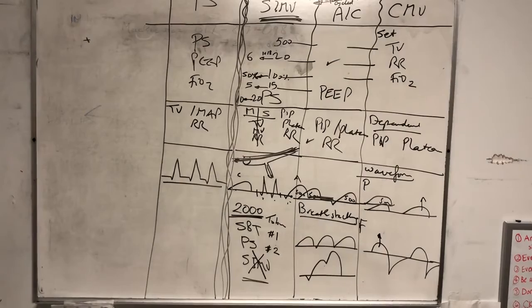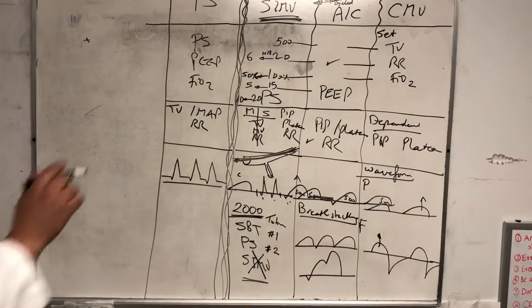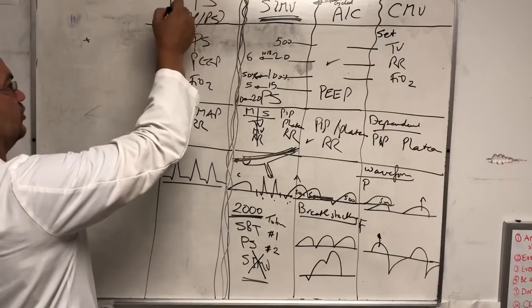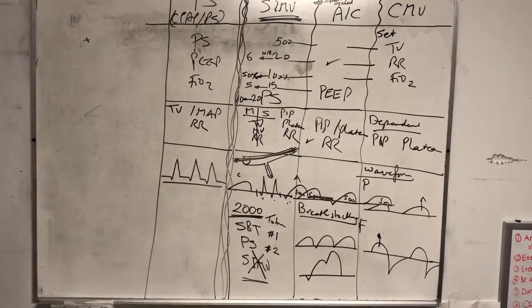So pressure support by itself is a misnomer. It's supposed to be called CPAP / pressure support. That's the mode. In fact, that's the mode that we have in our vents here. It's called CPAP / pressure support. It's a long name. Some people call it CPAP. Can I put the patient on CPAP? Yeah, I know what you mean, right?